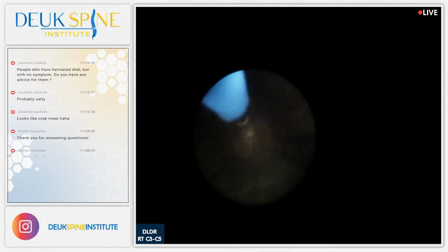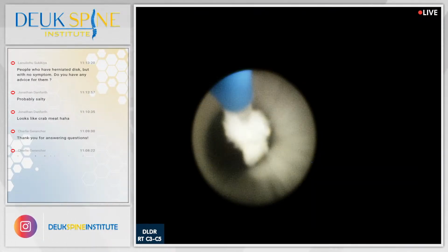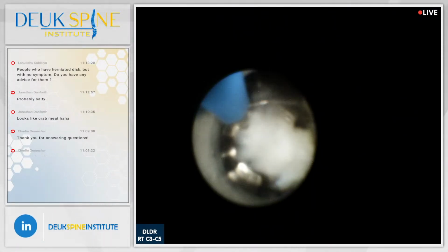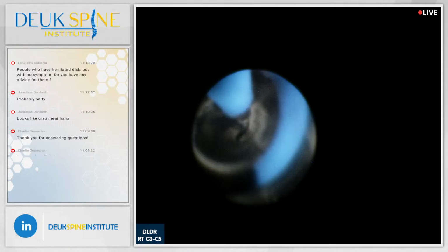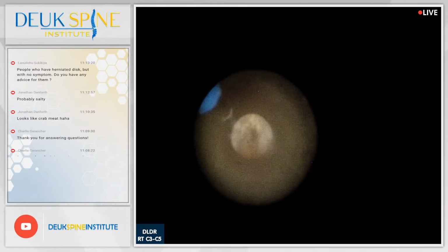Come on. Oh, where'd you go? You can run, but you cannot hide. I have an endoscope. I can see all. I think that's it.